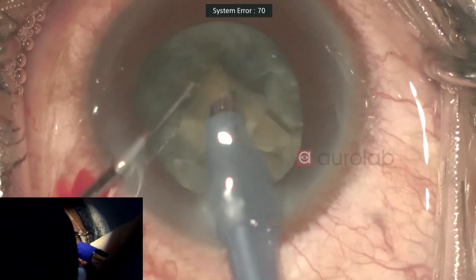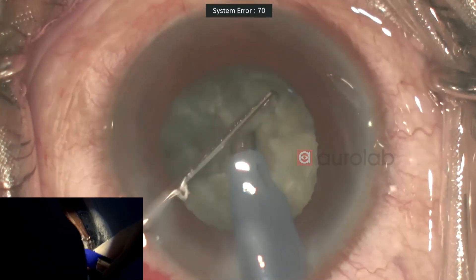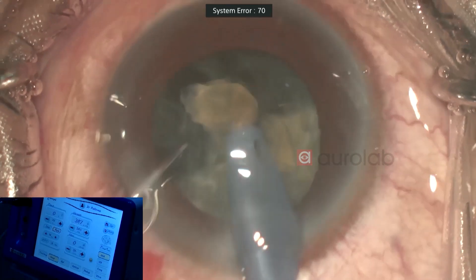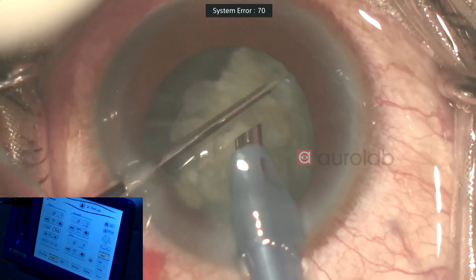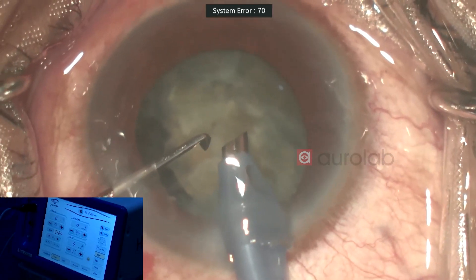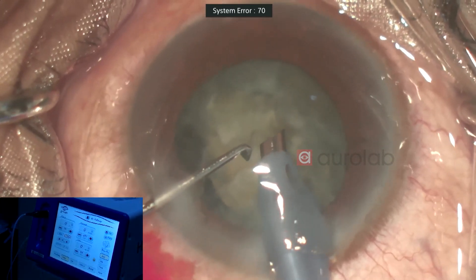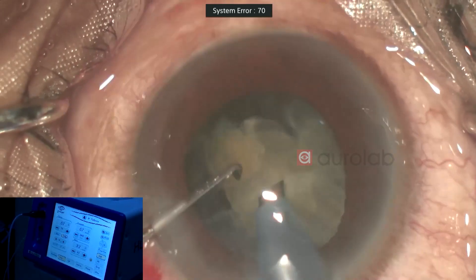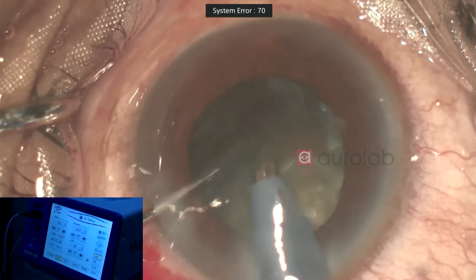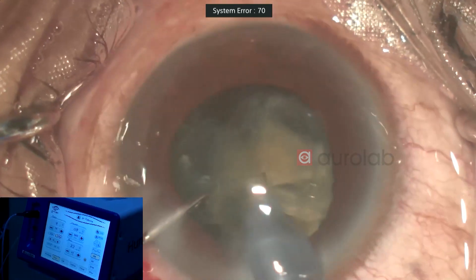This machine gives a stroke length of around 120 microns, which is good for occluding. This is a 45-degree Kelman tip. I'll share the parameters: I'm using pulse mode. The power is set in linear mode with a maximum of 75. For the phaco, the vacuum upper limit is 380 and the flow rate I've kept at 33.